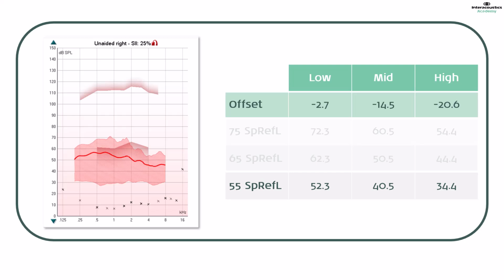Overlaid on this screen is the 55 dB ISTS, with the 30th and 99th percentile of the variation of the speech sounds shown. To determine how much of the signal at 55 dB would be audible for this patient without their hearing aids, we can look at how much of the signal is above their threshold.